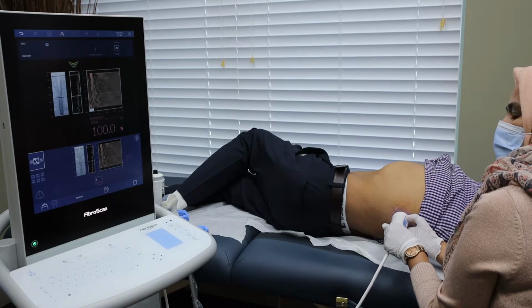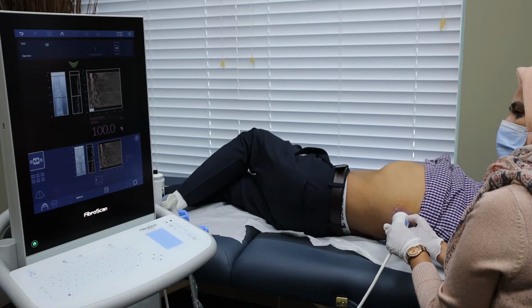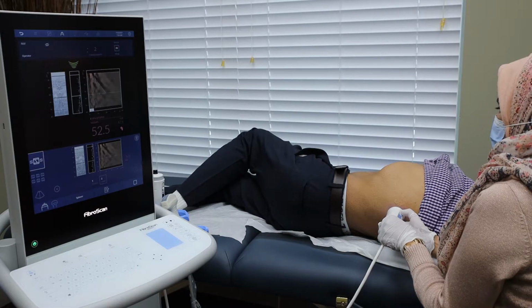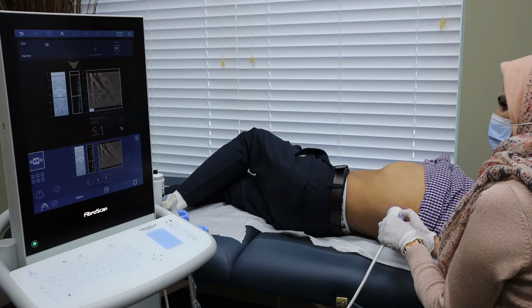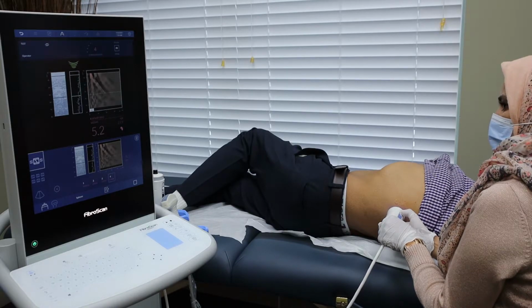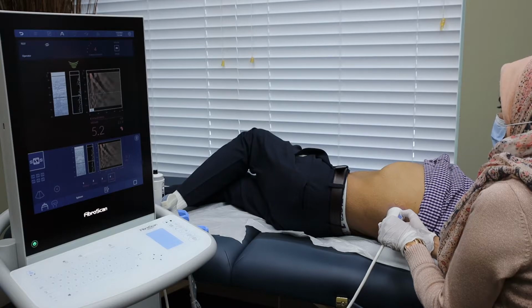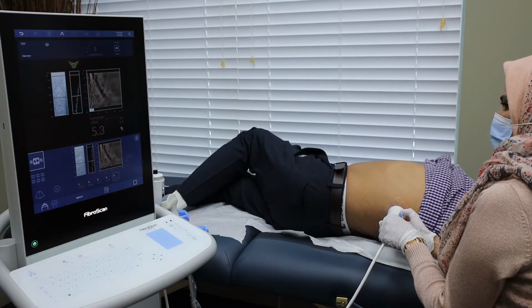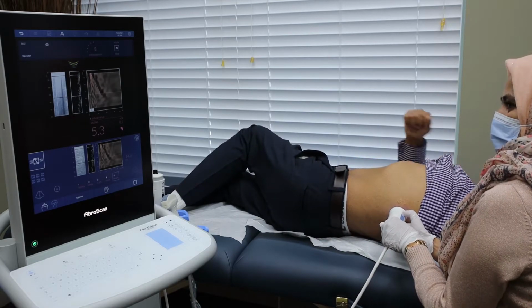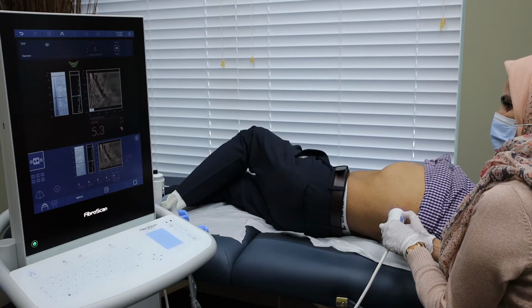The quality of the elastogram must be checked for each measurement. 10 valid measurements are to be captured. There is no IQR and median percentage for the spleen stiffness. The measurement depth for the spleen is up to 55 mm, and the final result is the median of all valid measurements. All inaccurate readings, including any measurements taken from non-spleen areas, will be automatically invalidated. A separate report will be generated for the spleen stiffness.